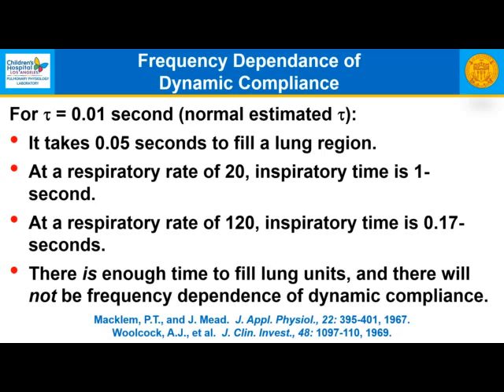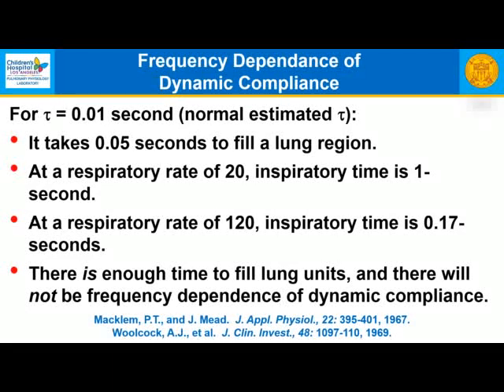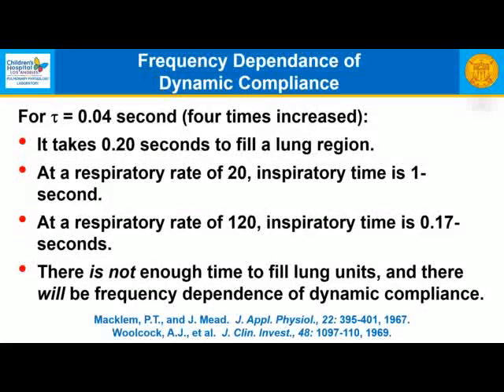At a respiratory rate of 120, inspiratory time is 0.17 seconds, so there's still plenty of time to fill lung units at rates of 20 or 120, and there will not be frequency dependence of dynamic compliance. However, let's take a patient with lung disease who perhaps has a time constant of 0.04, 4 times increased. So it takes 0.2 seconds now to fill a region of lung.